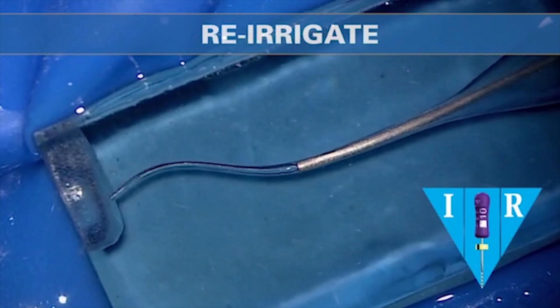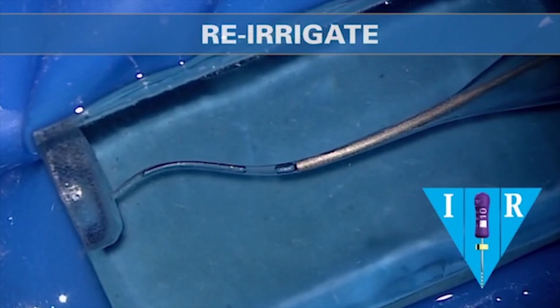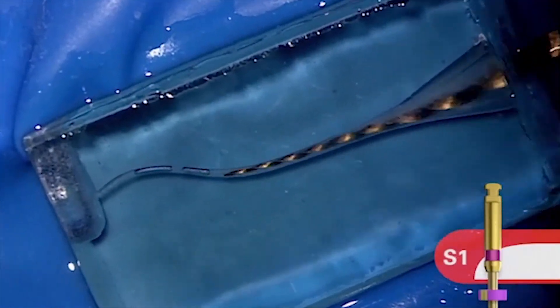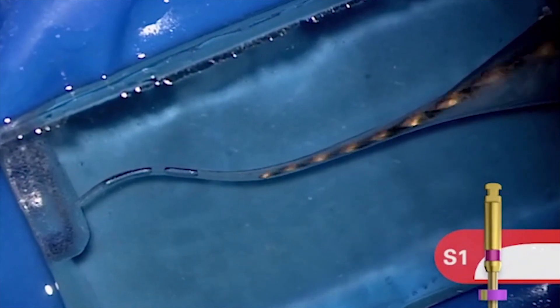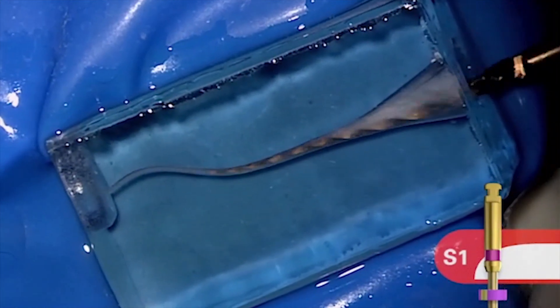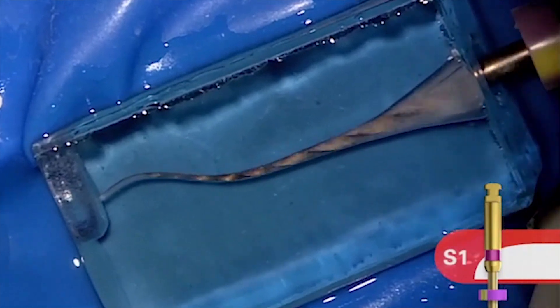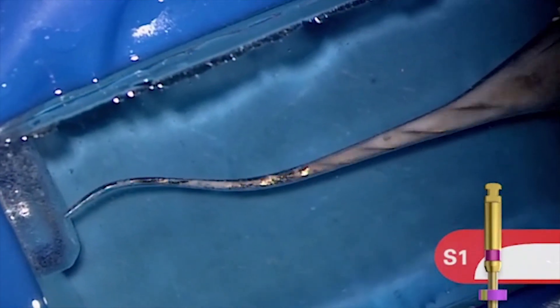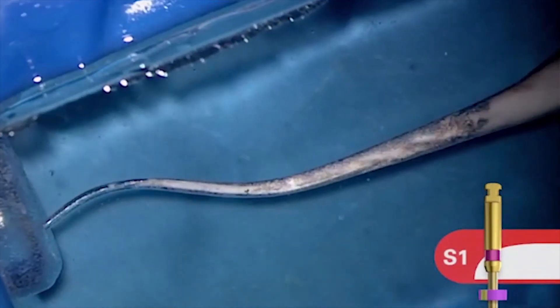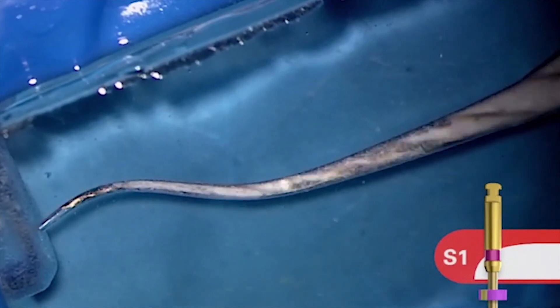Notice the cannula doesn't need to go deep — it only needs to go about to the middle one third of the entire working length. I can irrigate, vacuum, irrigate, vacuum. I'm using a 25-cent syringe with a 29-gauge cannula. Here comes S1. You don't have to know much about its geometries — it's purple. We know around the world the ISO color sequence to follow is purple, white, yellow, red. Notice I'm brushing. This canal is being pre-enlarged dominantly in its coronal one third. Notice where the file is loading up. The tip of S1 is just following the glide path that was created by the 10 and the ProGlider. Once we've achieved length, we can remove the file and again irrigate.